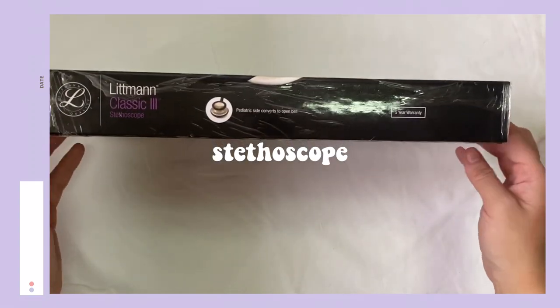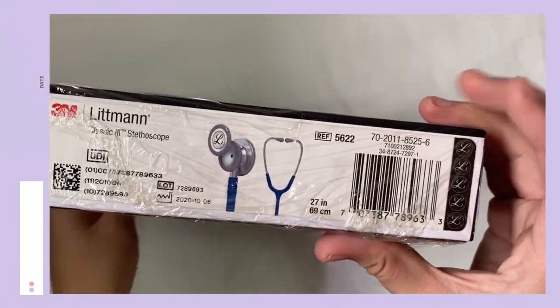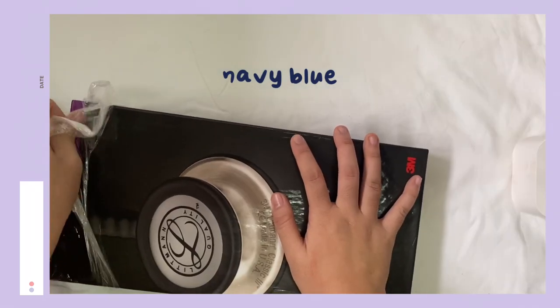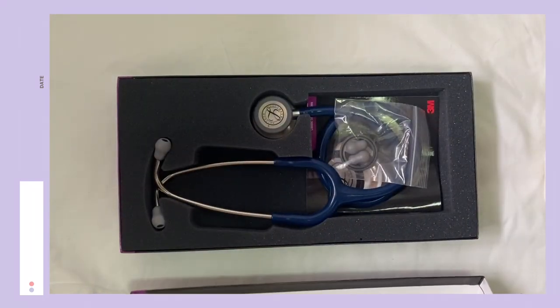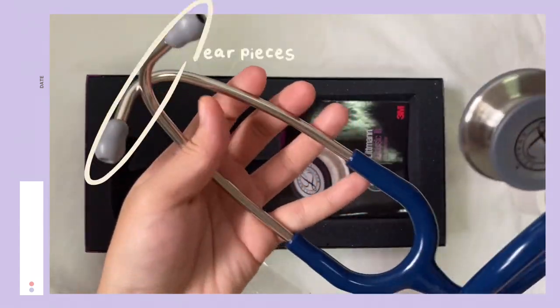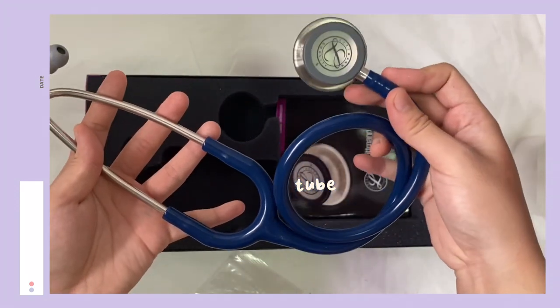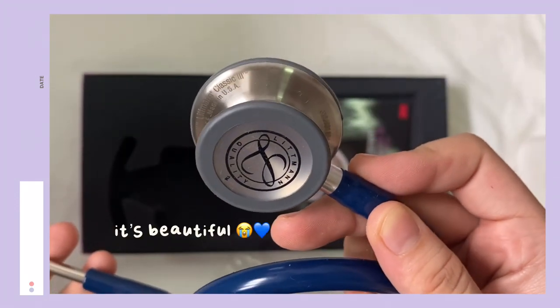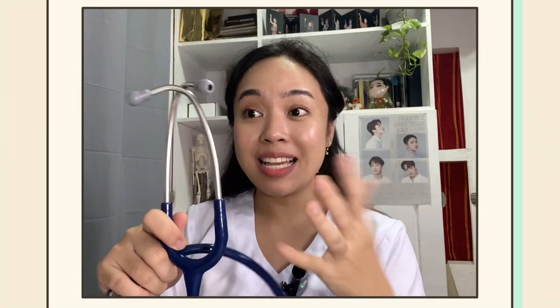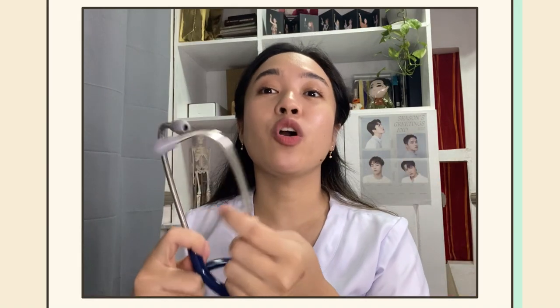And for the most awaited part, let's unbox this Littmann stethoscope. I got the color navy blue. It has a high acoustic sensitivity and can be used for both adults and pediatrics. The eartips are tight enough to fit comfortably in my ears. To properly fit the earpieces into the ear, make sure the direction of it is away from you — this is done to point the earpieces with the orientation of the ear canal in mind.